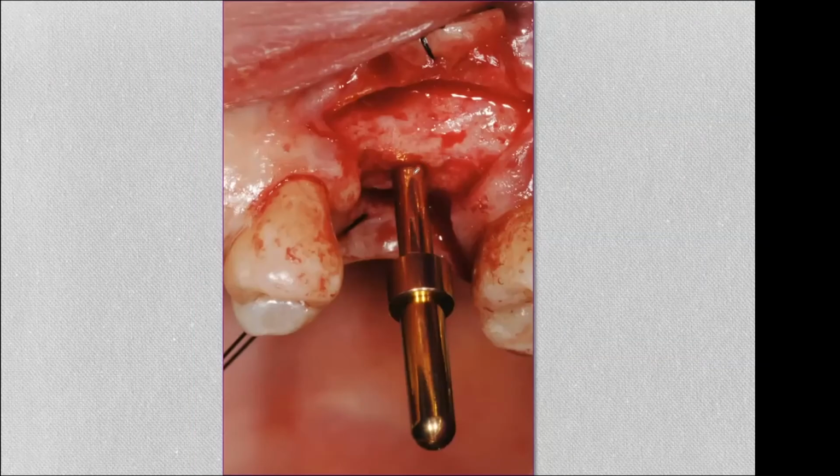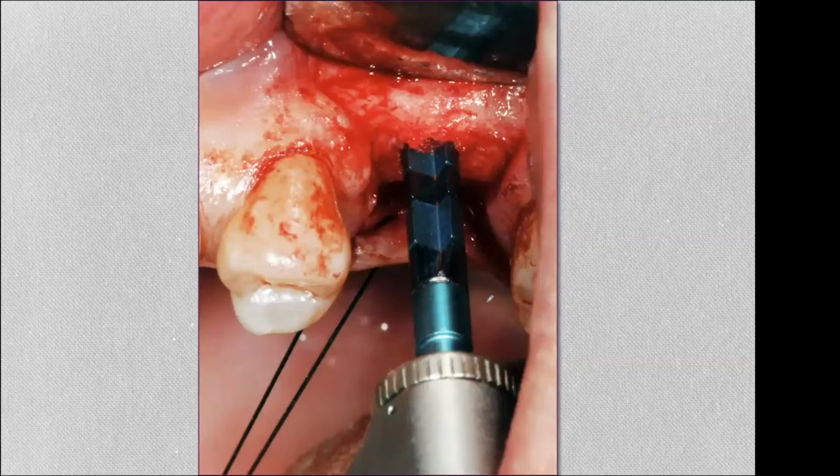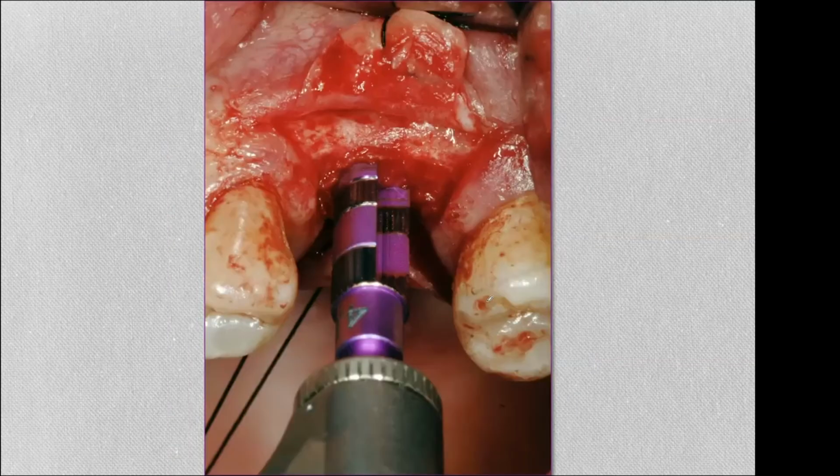We put the paralleling pin. You notice the paralleling pin doesn't go in very deep. That's because obviously it goes in until that pointed part of the pilot drill starts, and then it obviously is stuck. Then we start with the reamers. These are at very slow speed, 50 RPM or less, no need for irrigation. Again, we're going only to a depth of about 4 millimeters. Okay, that's the 3, the 3.5, the 4. And then when I get to this point, I noticed that the buccal plate was starting to show a little bit of a shadow. So I have about 2 millimeters or 1.5 millimeters.